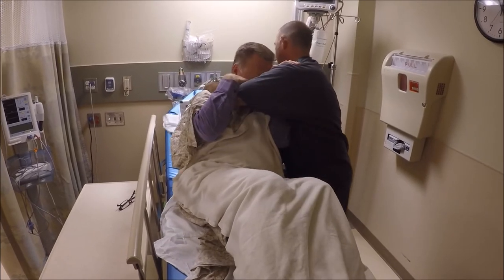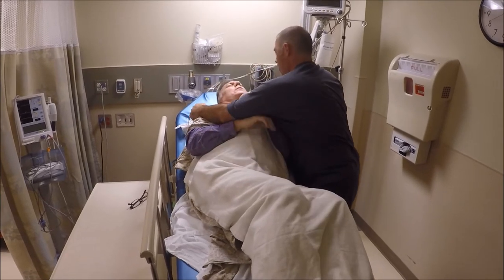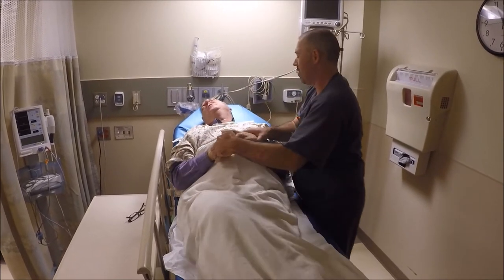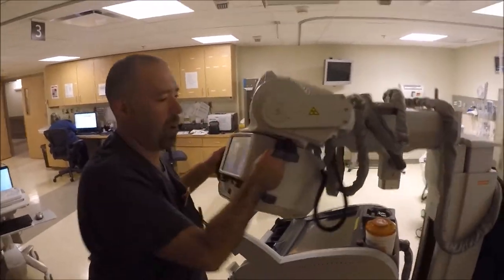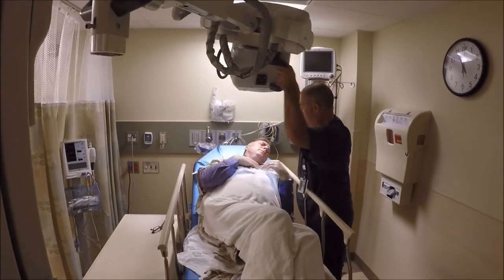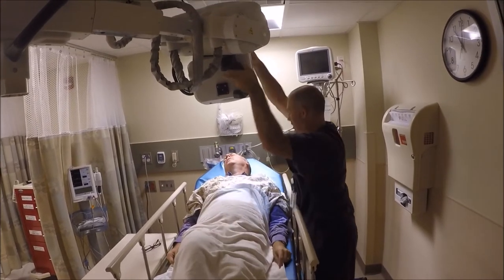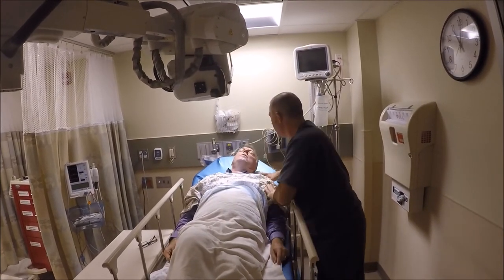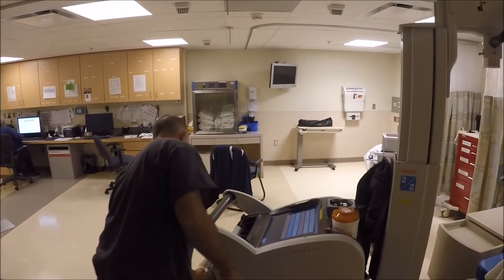Oh, there's a board on the pillow. Back we go. Try to hold still. Bring your arms down. Just relax — we're about done. Try to hold still for me. Hold still. Hold still. Here we go. Try to hold still. All done. Let's get this out of here.